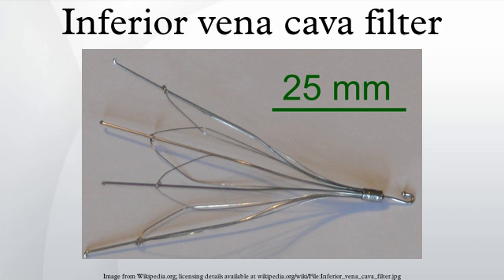Indications for use: while the ability to retrieve a filter does exist for many models, it cannot be guaranteed that all cases of filter placement will allow for, or be indicated for retrieval. Thus, the requirements and indications for permanent placement of filters is used to decide on when to use both permanent and temporary IVC filters. Long-term risk factors must be considered as well, to include life expectancy of more than 6 months following insertion, and the ability of the patient to comply with anticoagulation therapy. The decision to use a filter that is temporary versus permanent basically is tied to the expected duration of time that protection is needed to prevent pulmonary emboli from passing to the heart and lungs.